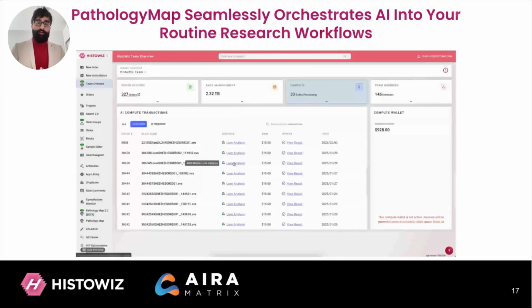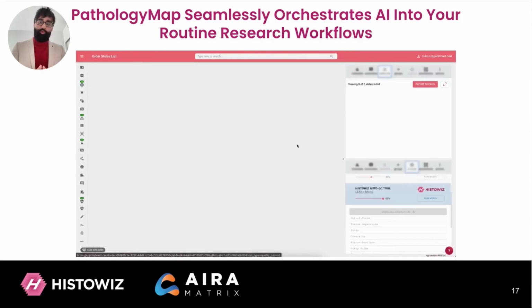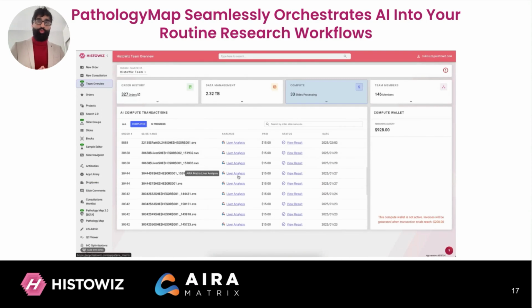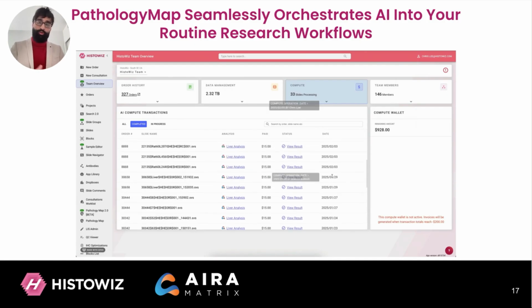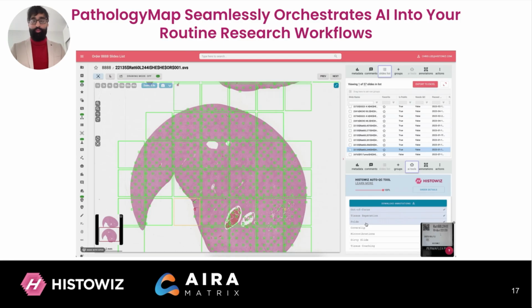So for that, we have the compute page on our platform, and this is where you can access all the information about your slides, what AI tools are available, and view results for the tools that you have already processed. You can think of it as a dashboard to essentially monitor what specific tools you ran on your images and further take action on your slides. And again, we will go over this in detail when I give a demo of the platform.